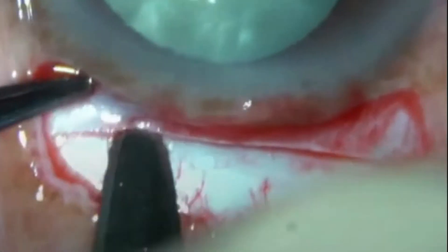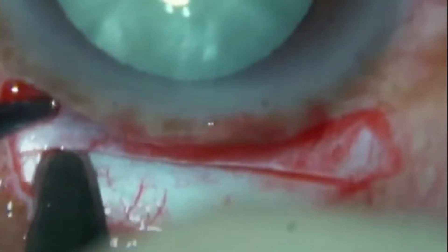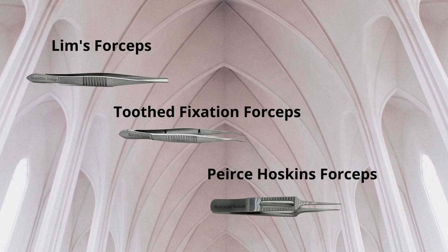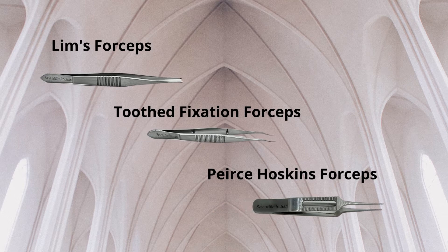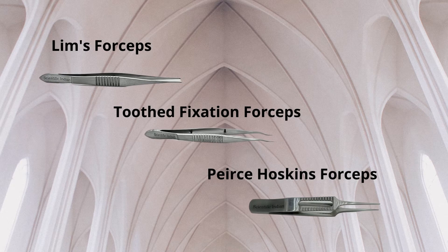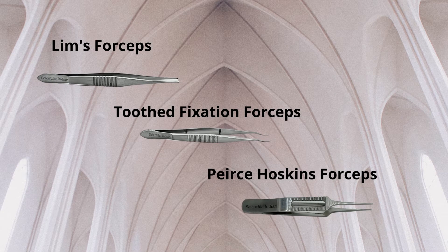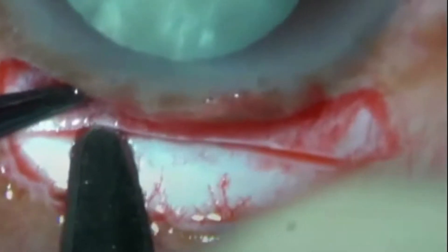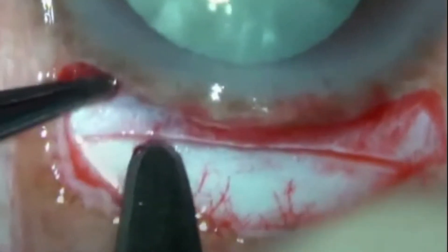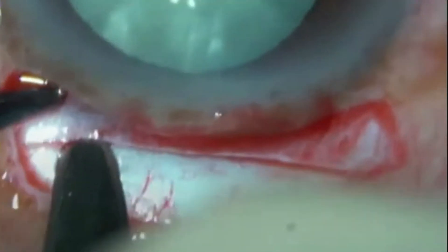Stabilizing the globe with toothed forceps makes tunnel construction easier. Lim's forceps, Peirce-Hoskins forceps, and toothed fixation forceps are often used for globe fixation. However, to avoid tunnel damage and leakage, the forceps should not be used on the tunnel flap. Sharp crescent knife and keratome should be used to construct the tunnel.